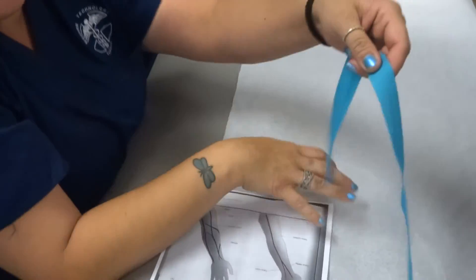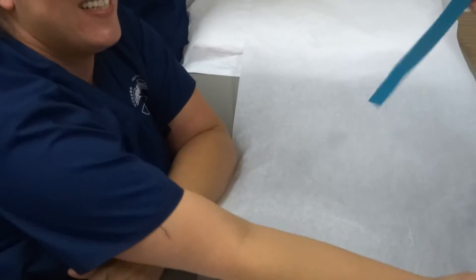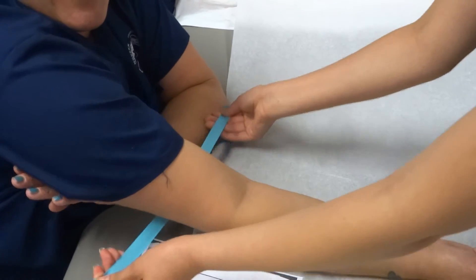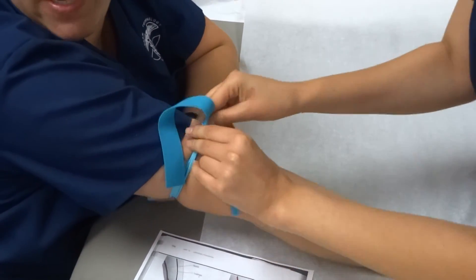The veins — that's my body's natural defense. But if you find it... Why don't you guys try doing tourniquets on each other and just palpate? So that's where I can go. I'll let Stephanie poke me.